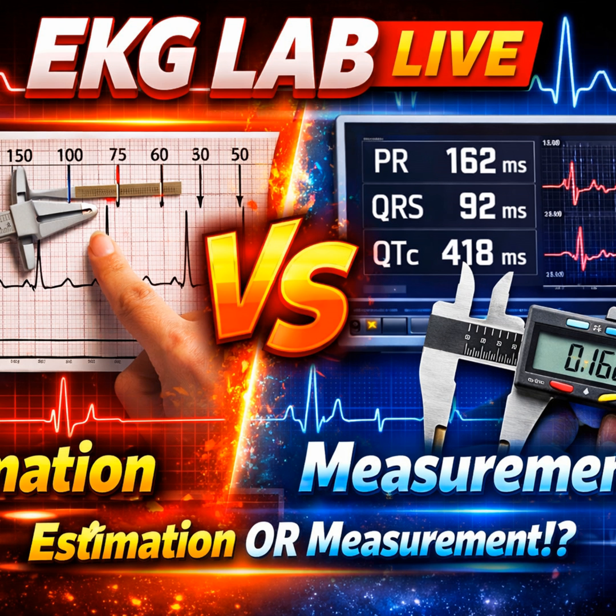But let's look at a killer like pulmonary embolism. You might be busy measuring the rate and axis, calculating degrees, but an expert using pattern recognition looks at the strip and sees the S1Q3T3 pattern: an S wave in lead 1, a Q wave in lead 3, and an inverted T in lead 3. That pattern is present in only 20% of PEs. It is historically famous, but statistically weak.